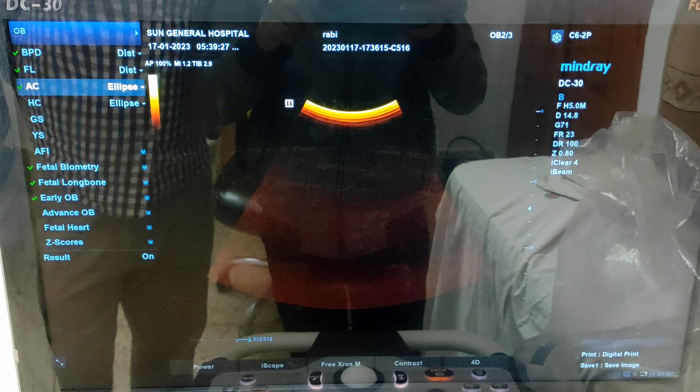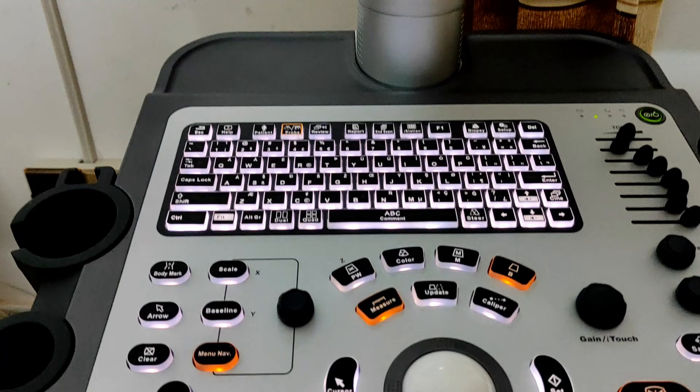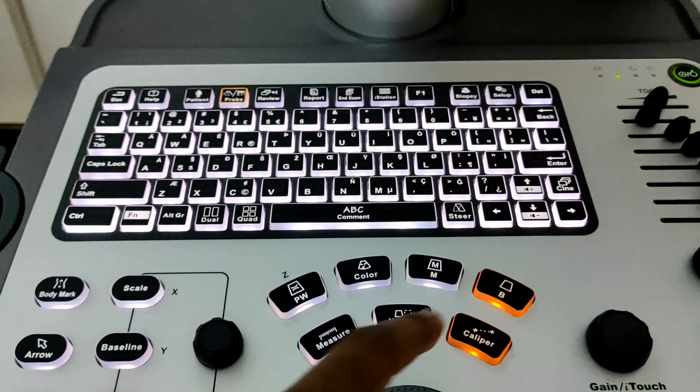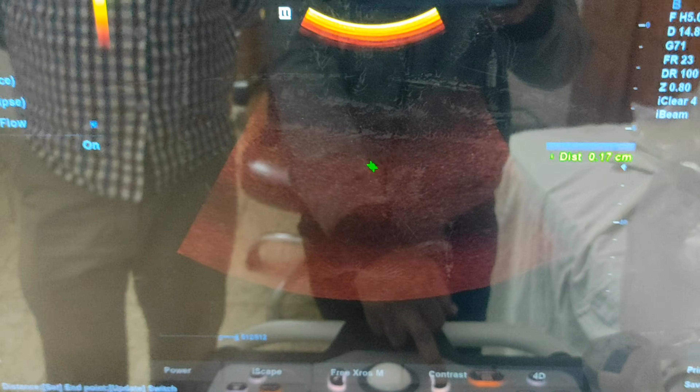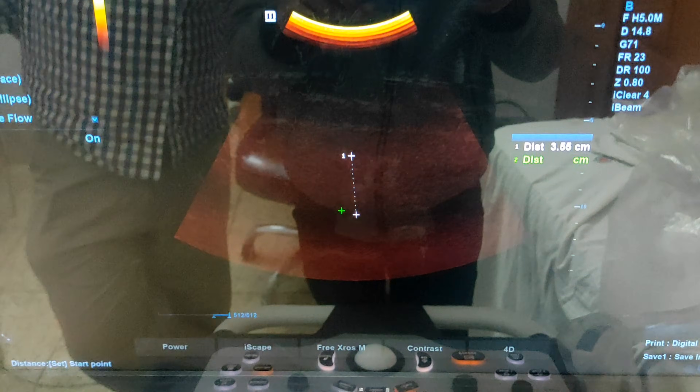If you want to measure any distance, here is our caliper button for measuring any type of distance. Just press the caliper button — a plus icon pops up. Press the set button to make a distance point, then create another point by maneuvering the mouse and pressing set. The distance will pop up in the right middle of your screen.